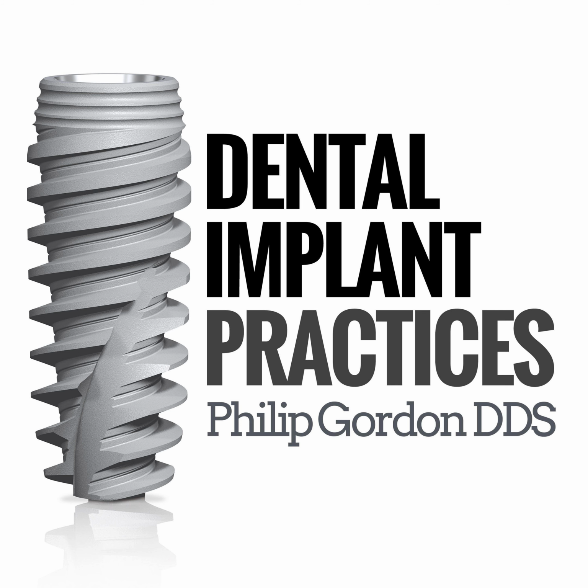Exactly. So yeah, once you have both bridges picked up, you do just those steps that you just listed there, and then a lot of times you're going to want to check the bite at time of surgery once. Absolutely, yeah. But the bite's going to be off. Yeah, no, it always is. Exactly. So give them a couple days, let the jaw reset.